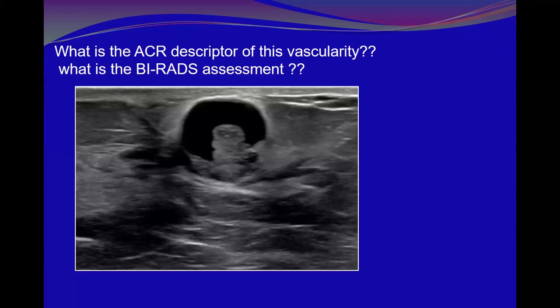Why do we suggest this to be soft tissue? Lobulated. Yes, it is microlobulated. The shape is taller than wide and microlobulated. And even here, there is an interruption in the capsule. Where the soft tissue is, there is interruption in the capsule, so it is even more suspicious. It will be BI-RADS 4C, okay?